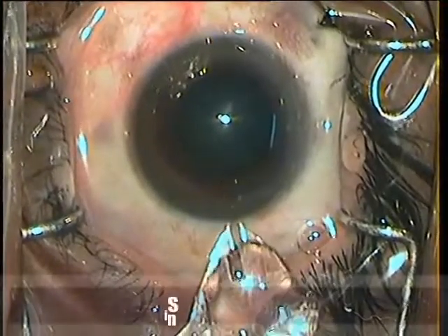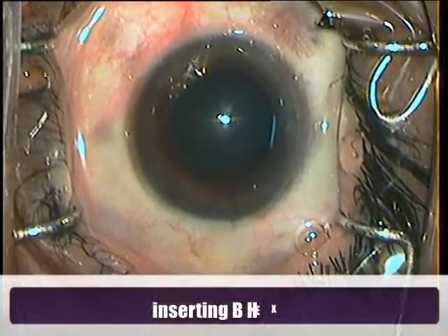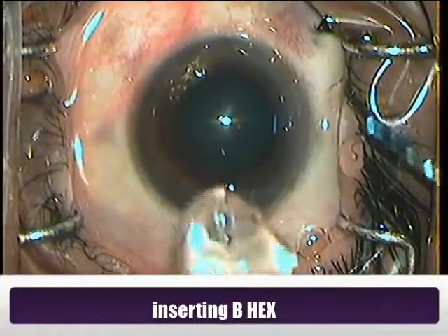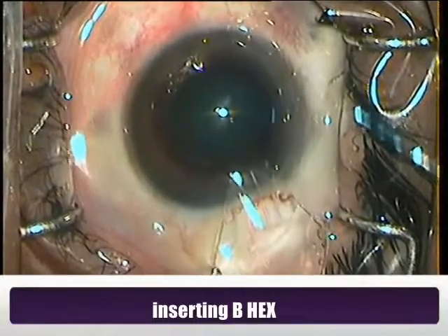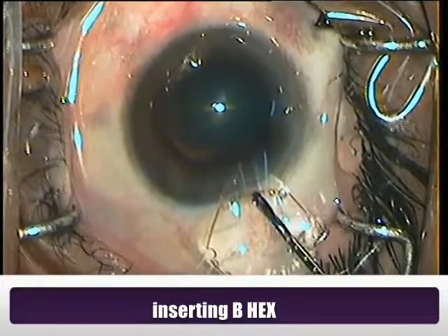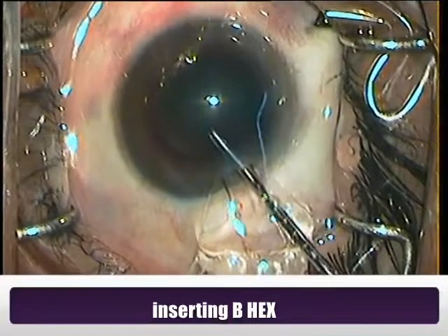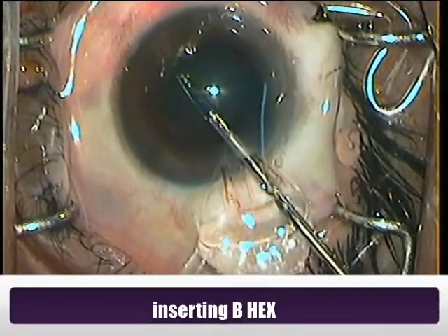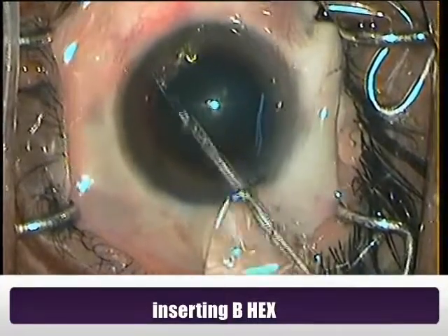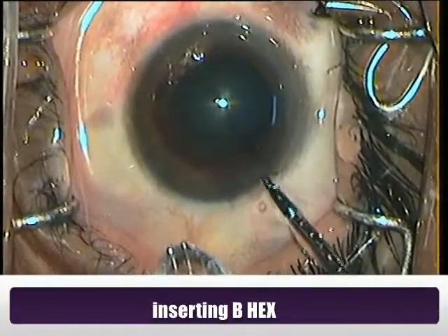This is the B-HEX cartridge. I place visco over it and with a 26 gauge forcep, I gently glide it into the anterior chamber. There it is going in. Take it as far as possible and then push the trailing part into the AC.